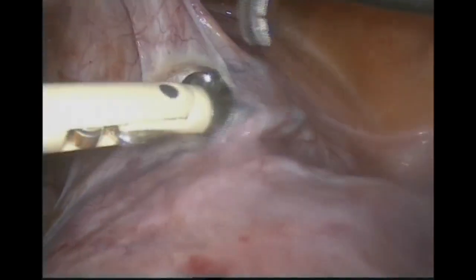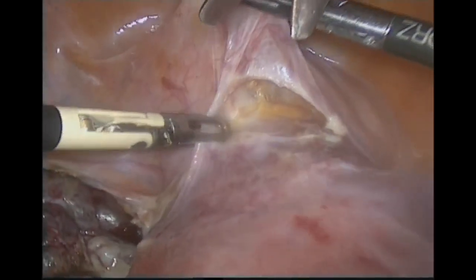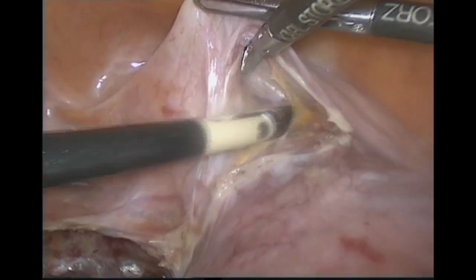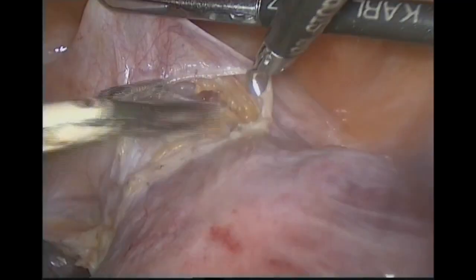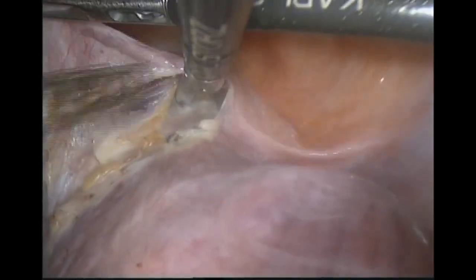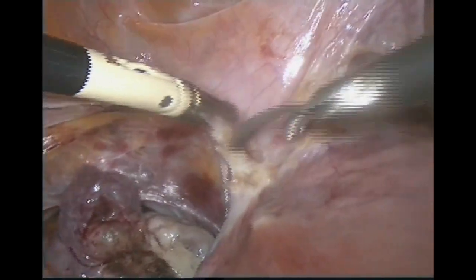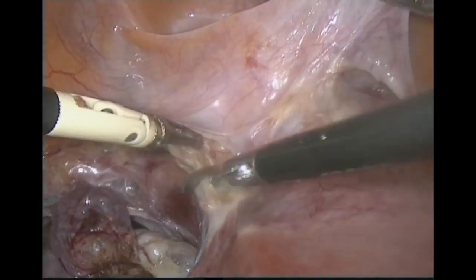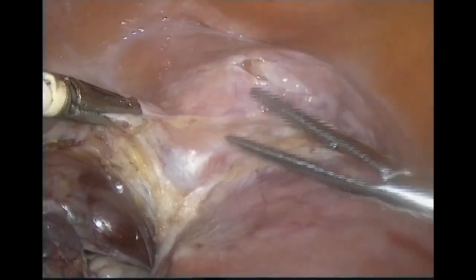the uterine artery. Then go to the vesico-uterine fold. A very important tip is bladder dissection. Develop the vesicovaginal plane by sharp dissection and gentle traction, with counter traction by another grasper in the other hand. Then go with bipolar and cold scissors, using the scissors here to avoid any bladder injury and to avoid any vaginal fistula afterwards.